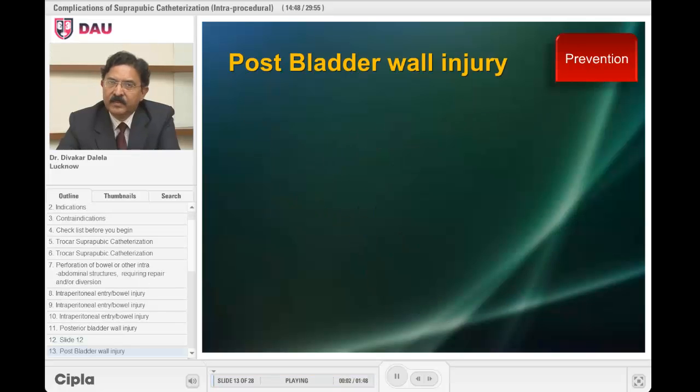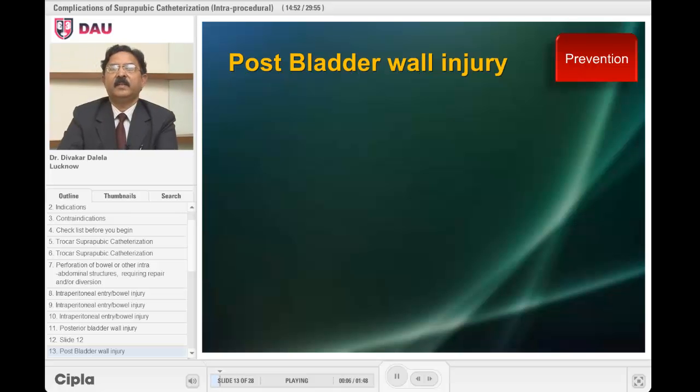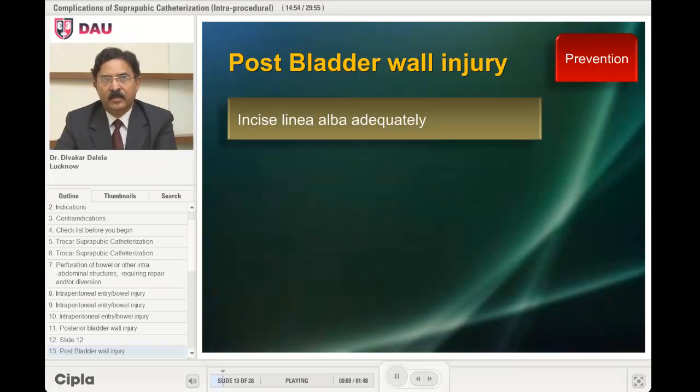How can you prevent this? I have already given you a hint. The best prevention is, first of all, incise the linea alba adequately, make an adequate hole, and you can see the video on this site, how to do a trocar cystostomy, operating video. There I have already specified this point.